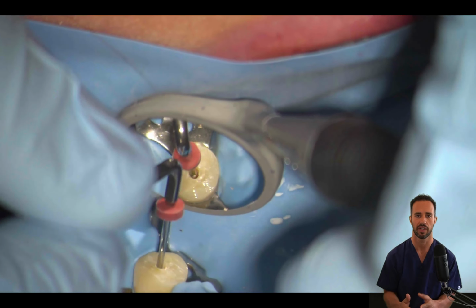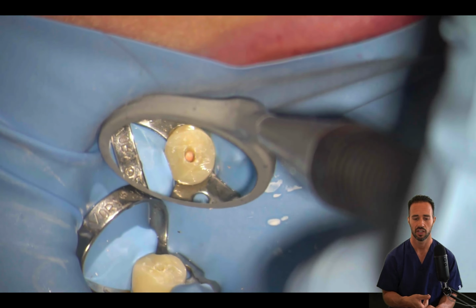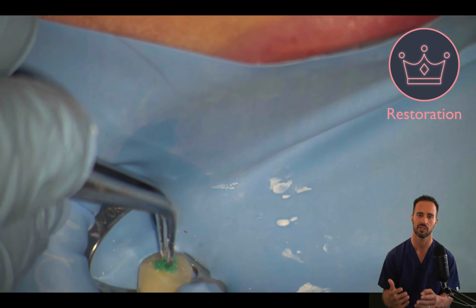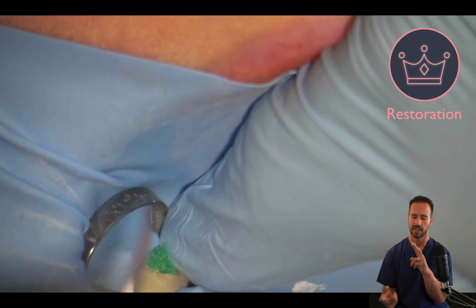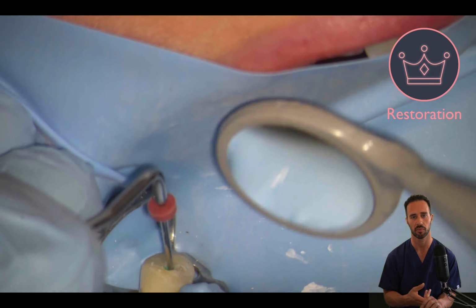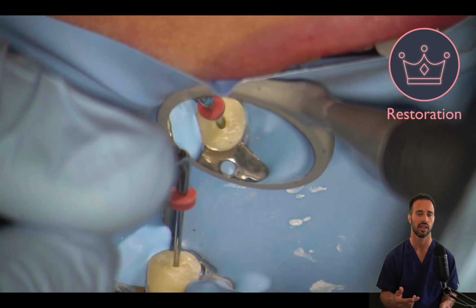That's going to be a very, very profitable appointment, okay, because you're going to have the root canal treatment done in less than 20 minutes once you get good at this, and the core buildup done in just a few minutes more. So think about how amazing of a service you're providing for the patient, minimizing the number of appointments, giving them this kind of treatment in the comfort of your own practice, which they're already happy going to your practice, obviously, since they're a patient of record, and going ahead and doing that for the patient.